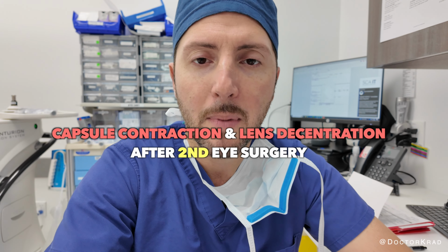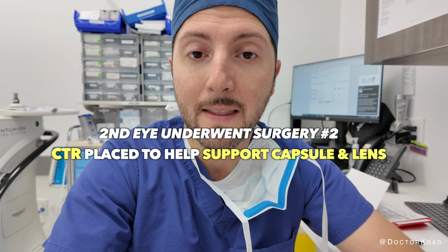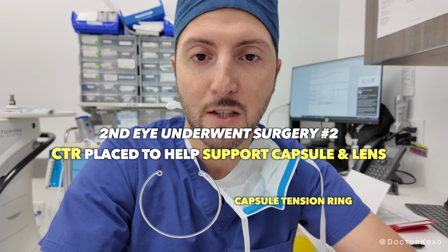And so the doctor thought maybe it's because of the centration. So they went back in there and tried to center the lens. And when they were doing that, they put in a CTR, capsule tension ring, to try to stabilize the bag to make sure that it has good support and therefore supports the lens centration.